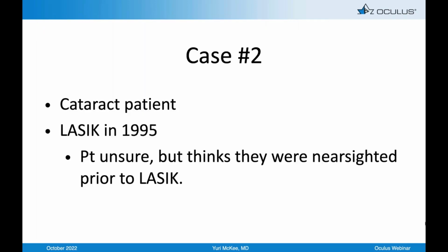Let's go to the next case, a cataract patient. They had LASIK in 1995, so early generation LASIK, unsure, but they think they were nearsighted prior to LASIK. And funny how we forget if we were nearsighted or farsighted so long ago. So here is the Holladay report.